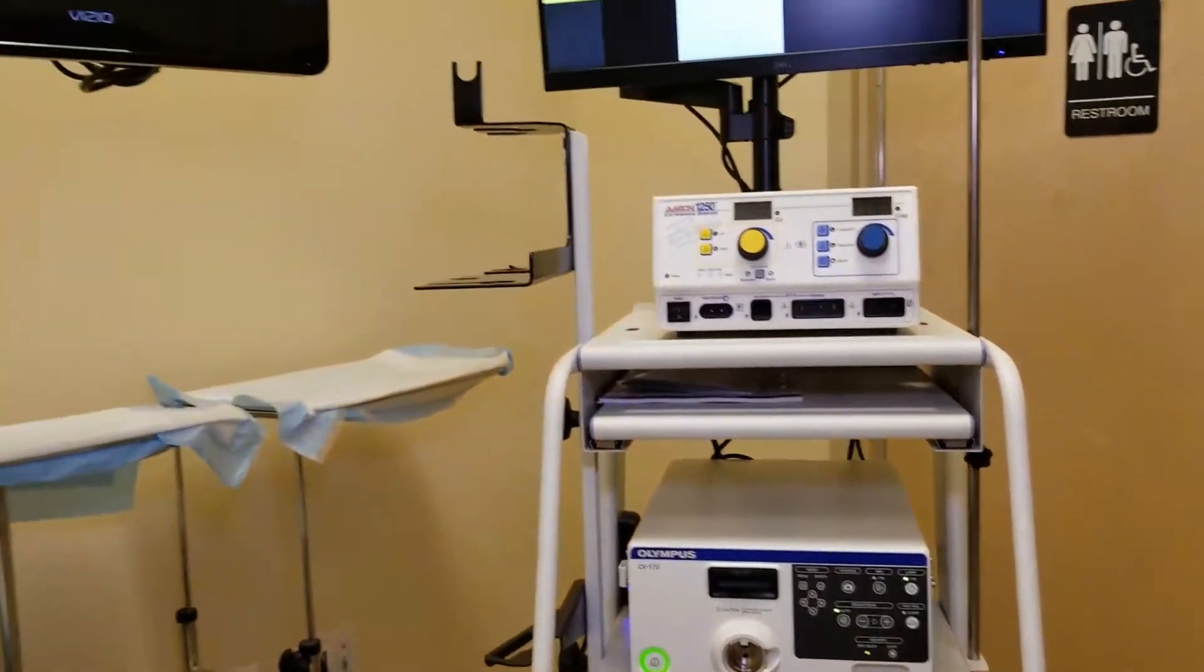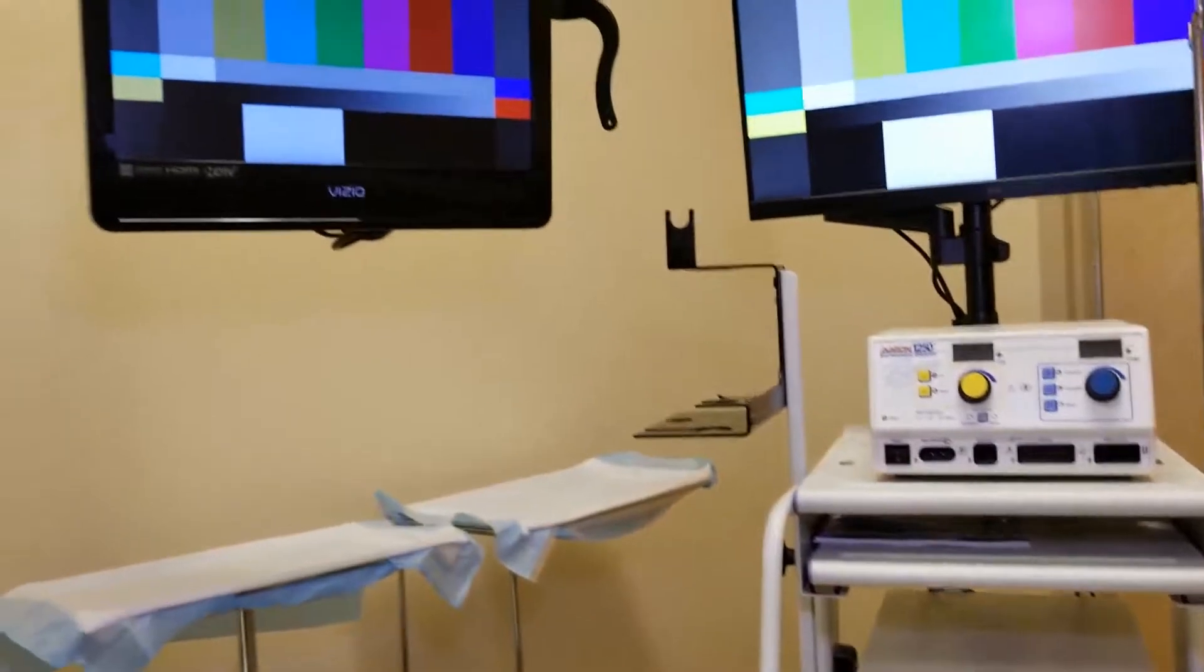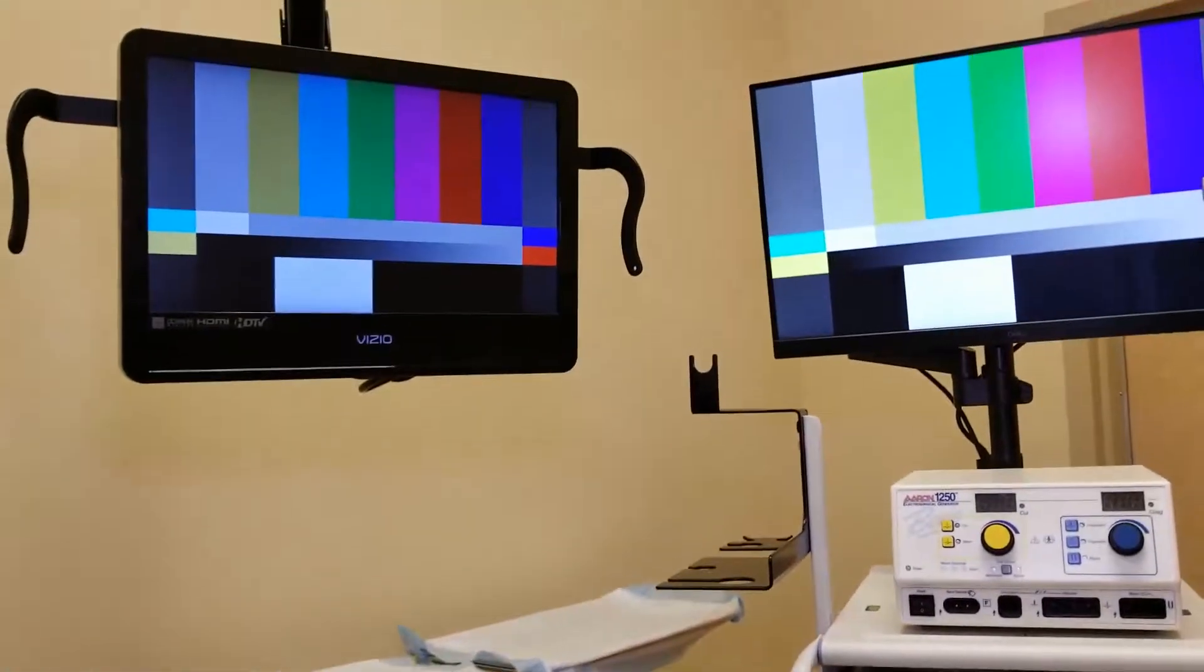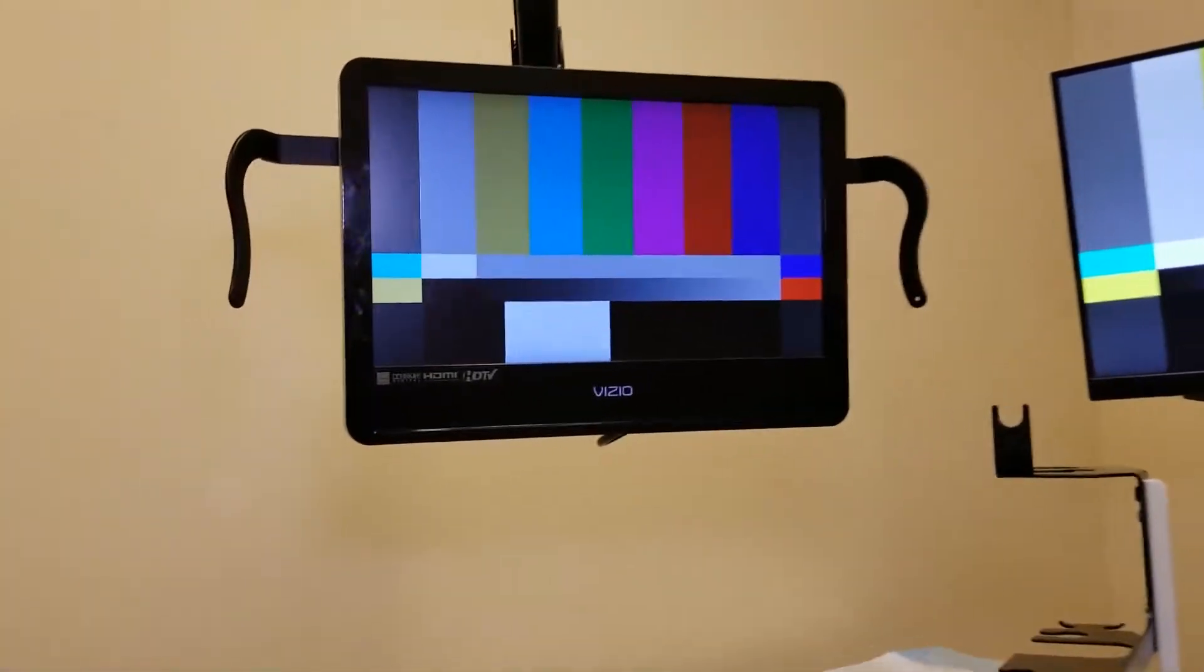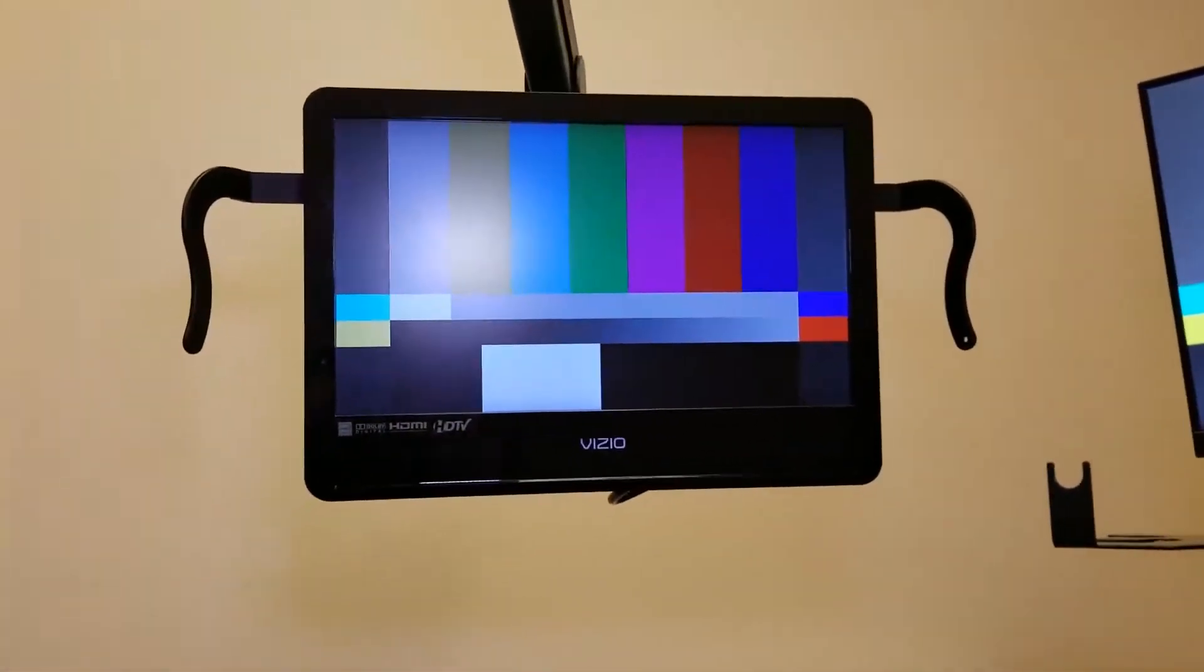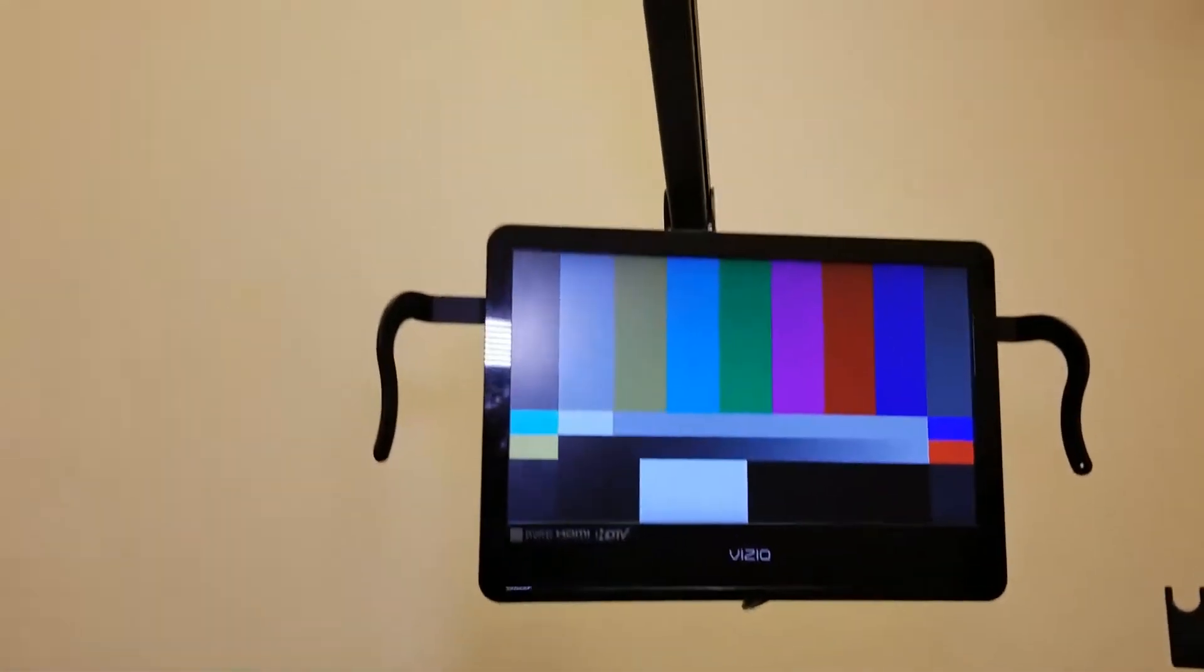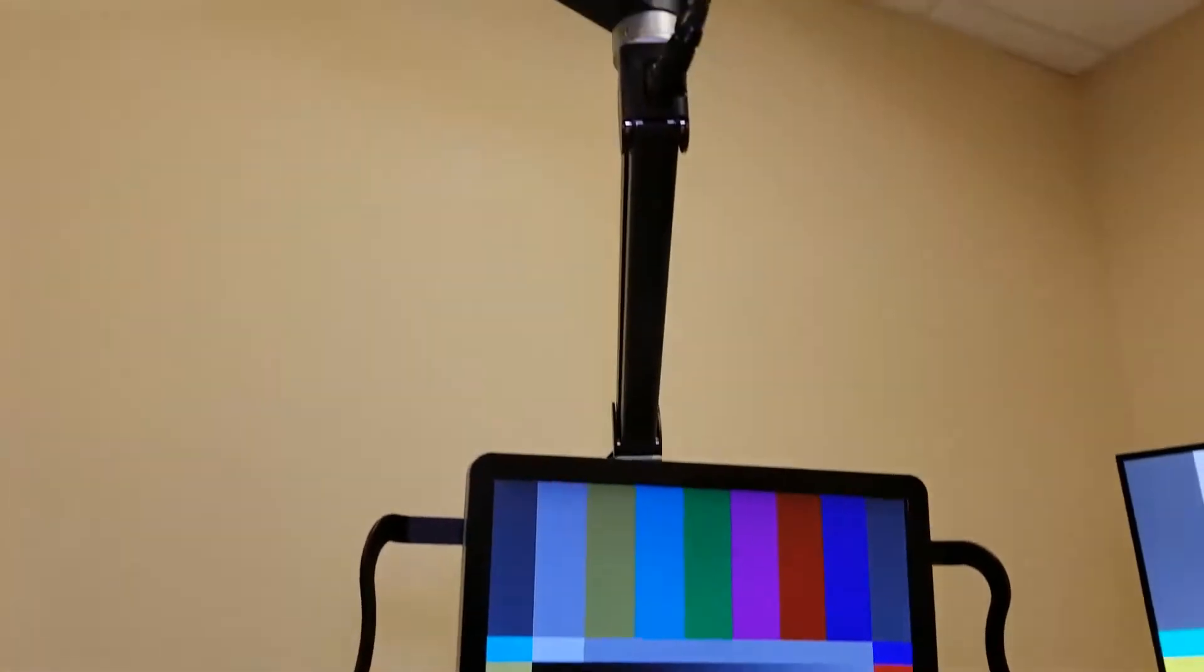In my office, I actually have two monitors set up. This monitor is the one that I use when I perform the procedures and is mounted on a ceiling boom.